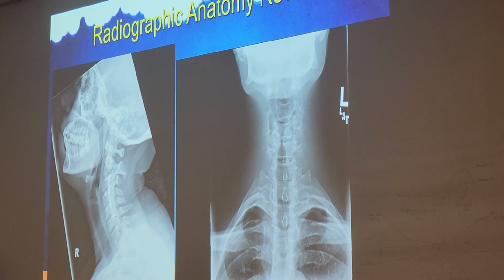Stricture. Stricture, like restriction? This is from the same PowerPoint I gave you guys. It's called stricture. We talked about it a year ago. That'd be something good to write down. The narrowing that we see on a soft tissue neck in the trachea would be something we call stricture. S-T-R-I-C-T-U-R-E. Stricture. Narrowing of the soft tissue neck.